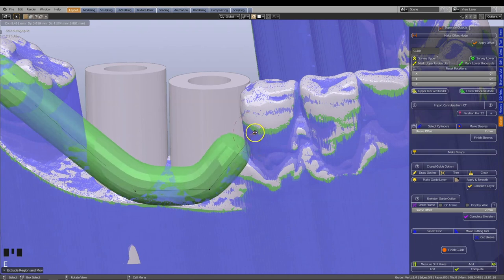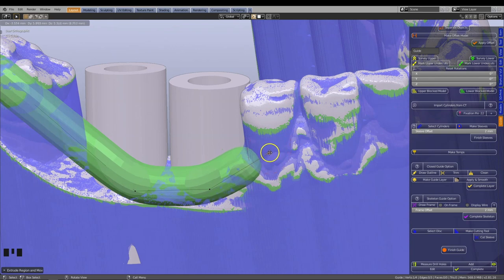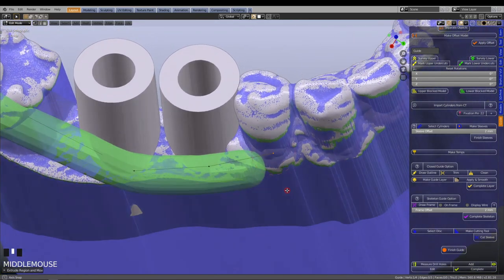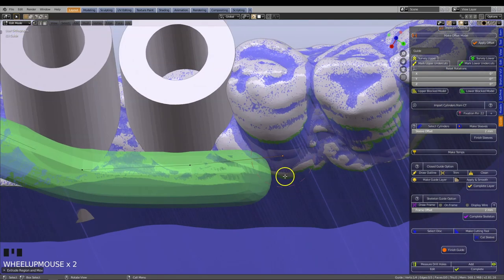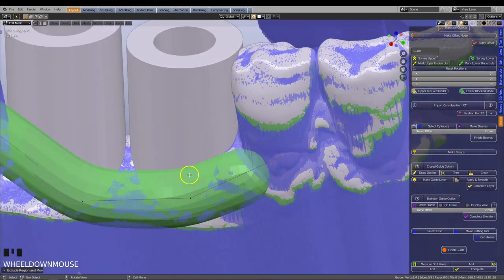Always consider the best point of placement. Here for example, if you were to position the line in the blue area, the finished frame would sit away from the tooth surface due to the nature of the undercut.